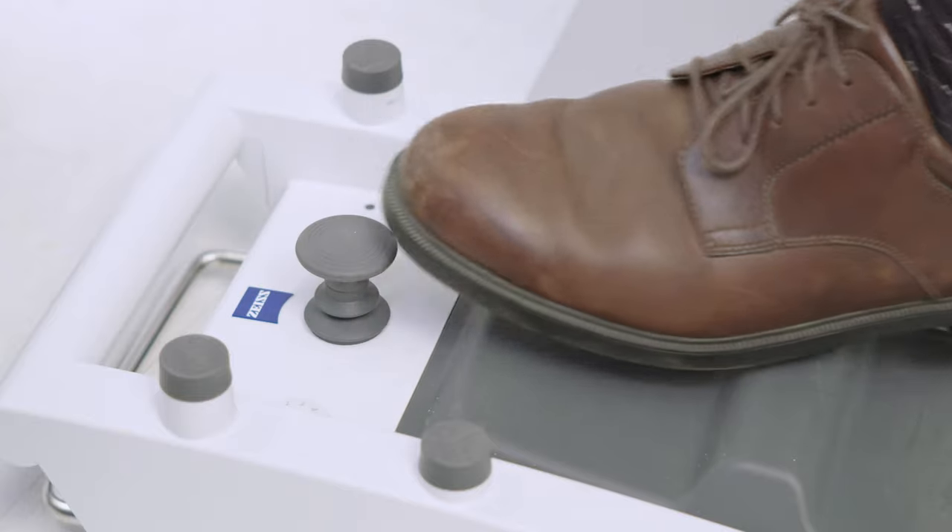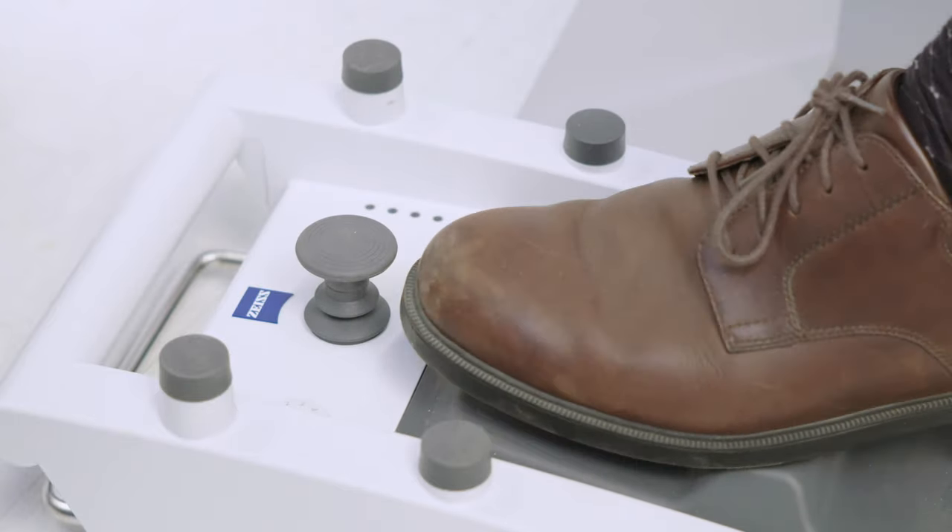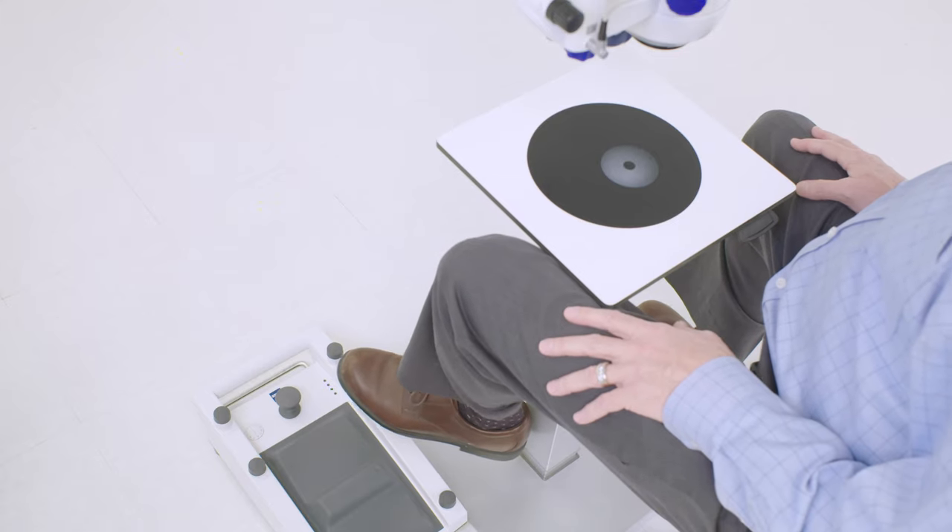Use the joystick on the foot control panel to move the XY on the microscope as well as change the focus, zoom, light on and off, and brightness.